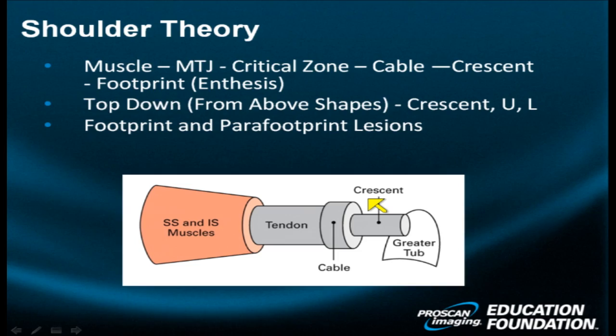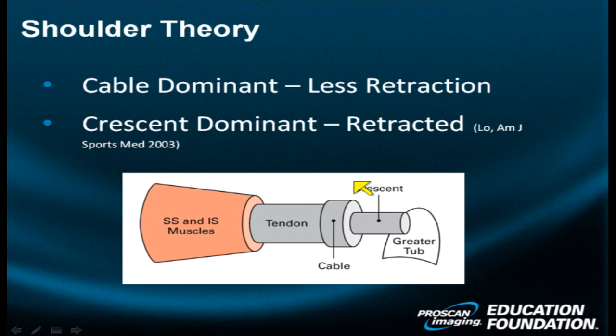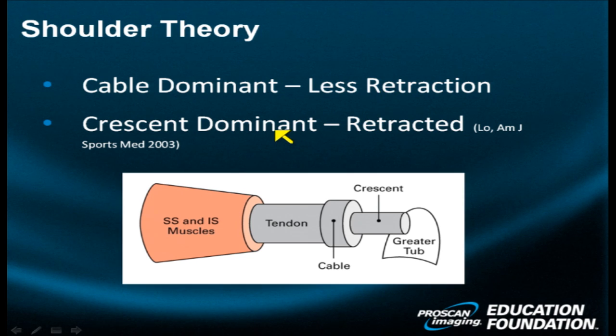When you look from the top down, many have described the shape of these tears as either crescent-shaped, U-shaped, or L-shaped. The shape depends on whether a shoulder is cable-dominant or crescent-dominant. In a cable-dominant scenario, because the cable is thick, strong, and fibrotic and restricts motion, there is less retraction. In a crescent-dominant shoulder, where the cable is thinner, there will be a greater degree of retraction and you are more likely to see a deeper U-shaped tear.